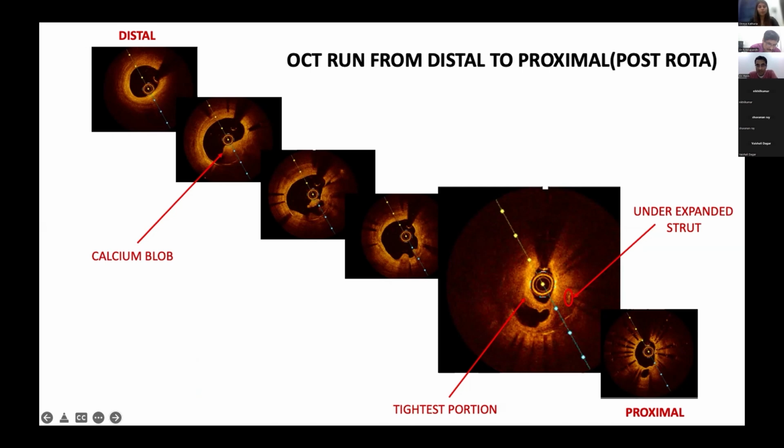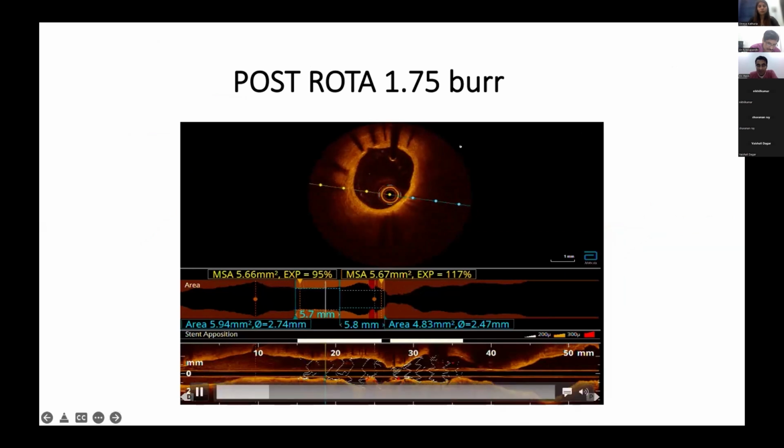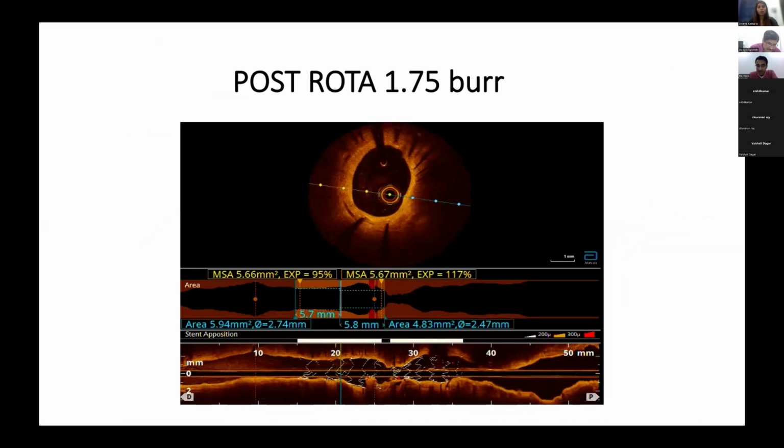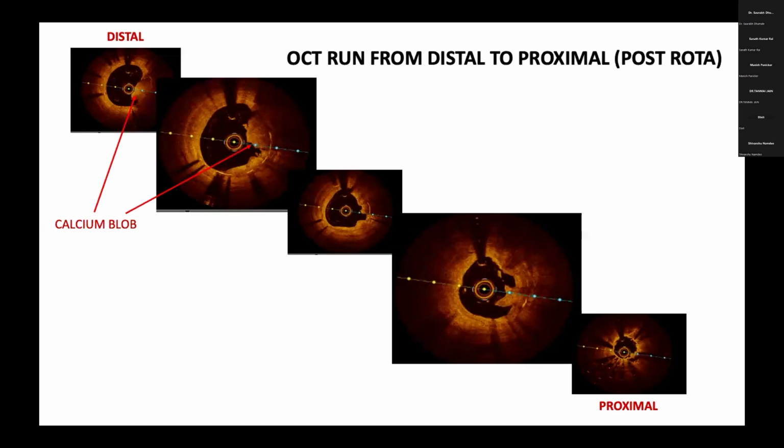So going further, I decided to upgrade my rotablator to a 1.75 millimeter burr, and this is the image which I got after the 1.75 millimeter rotablation.